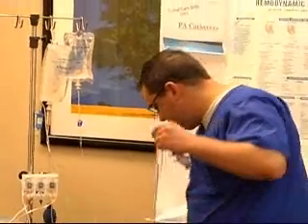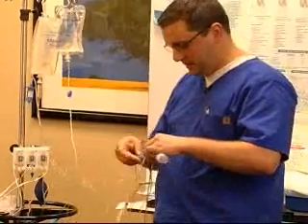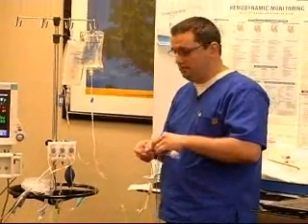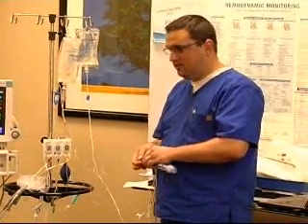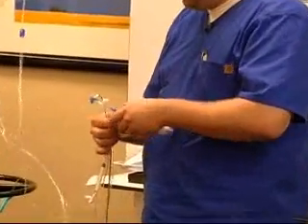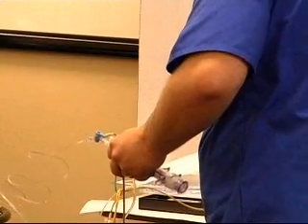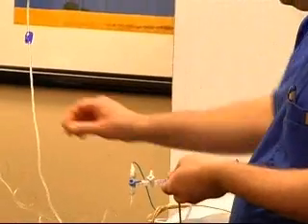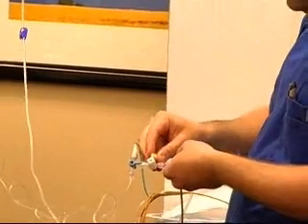Now, there's not any discernible research that says that this has to be hooked up directly in line with this. Now, physics might be easier to do. I don't know. I really can't find any difference. So connecting it to the side of this port is acceptable. It's a matter of however you want to do it. Doesn't matter. Okay? And making sure that we have all the caps that we're not using. We'll use these blunt caps. Of course, change them out on our system as well. I'm not going to do that right now, but you replace the vented caps for that. And I'm going to put one on here.